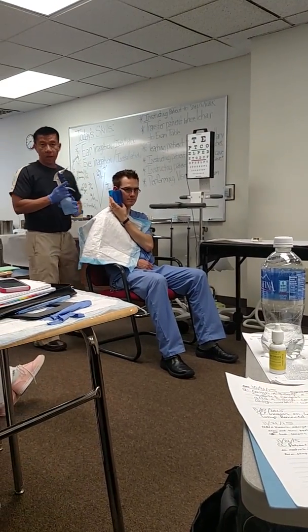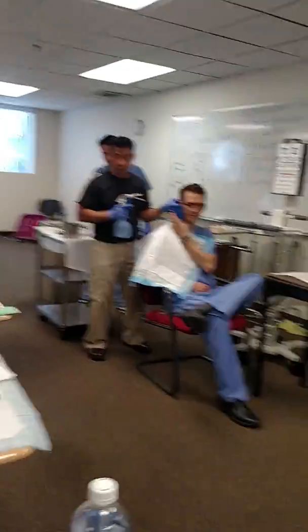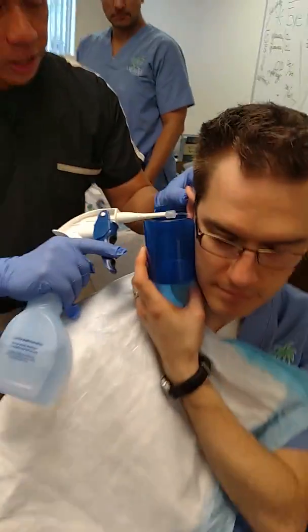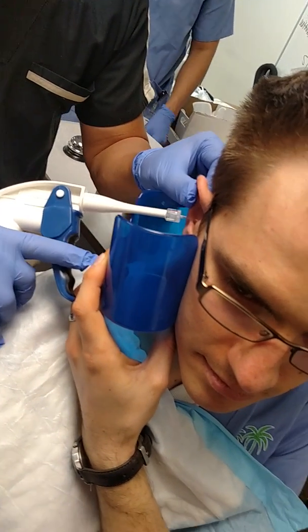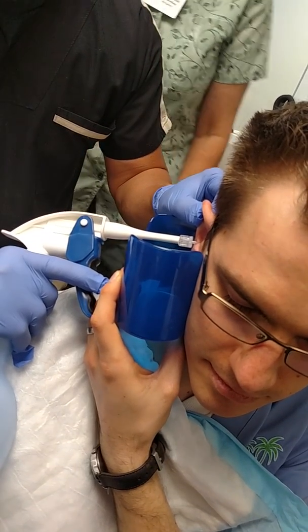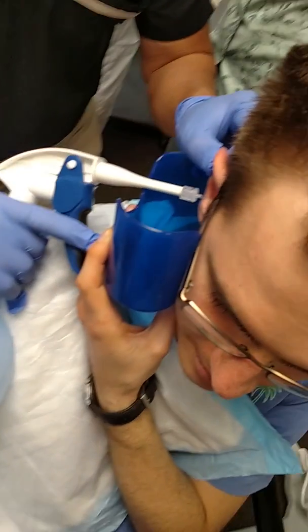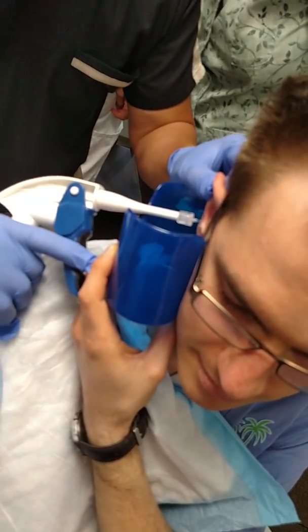So now, if you want to come up closer, stand up and come closer to me. I'm going to show you how to do it. Pull the patient's ear back and up, and insert the tip of the device onto the patient's ear and point it at the roof of the ear canal. The roof. Are you guys with me? So you start to slowly press this.